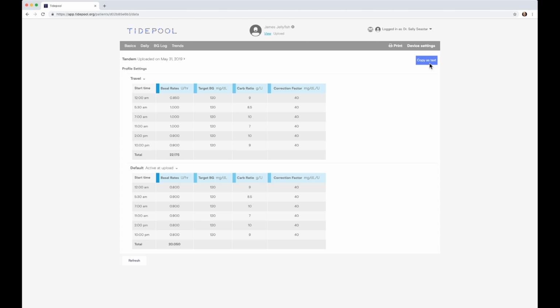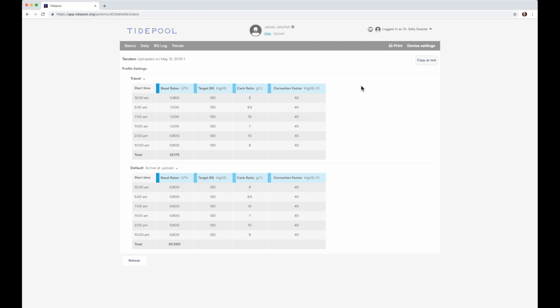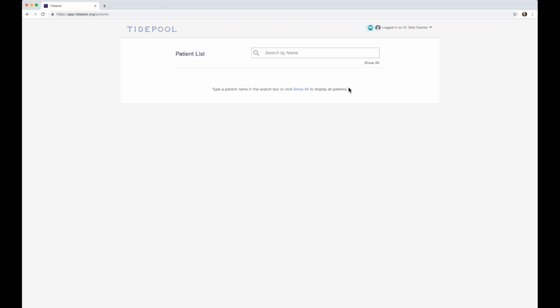However, you can click this copy as text button and paste all of your patient's pump settings directly as text into their patient record or electronic health record as you see fit. And this is the other way that we currently offer to get Tidepool data offline. Once you've finished reviewing data for a given patient, simply click the care team icon at the top and you're brought back to the friendly search bar and you're ready to start the process all over again.